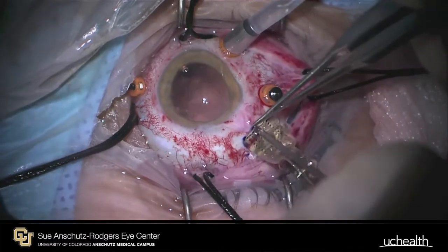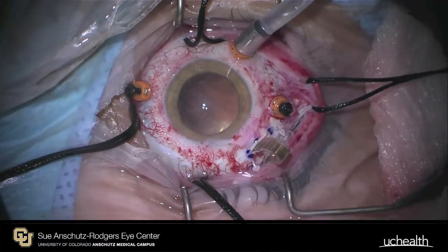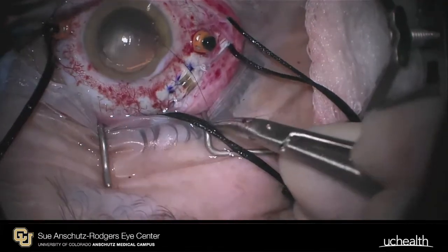Next, rubber-tipped forceps are used to carefully deliver the electrode array into the vitreous cavity. The cable is gently advanced until it is flat against the globe. Anchoring sutures are used to begin closing the sclerotomy.